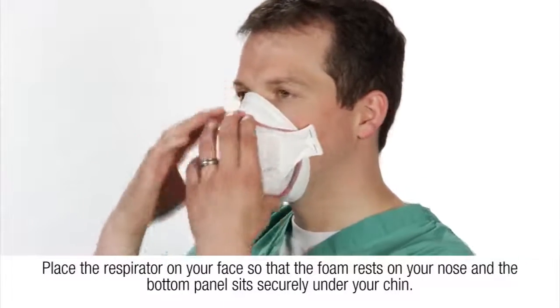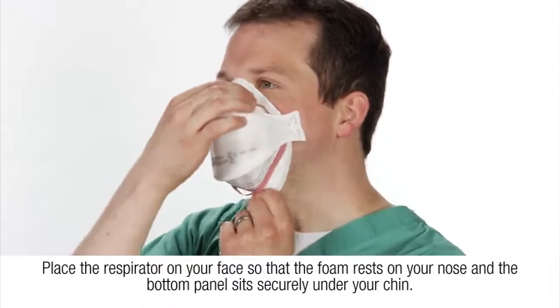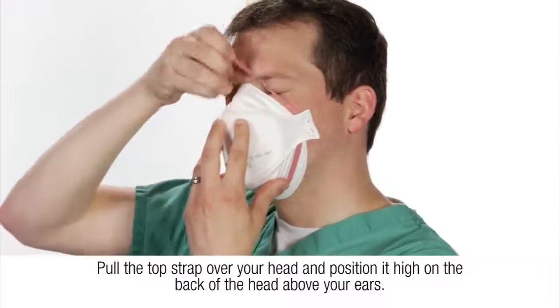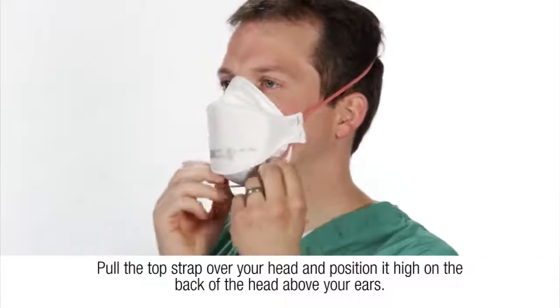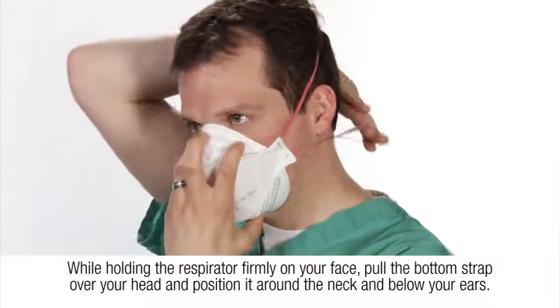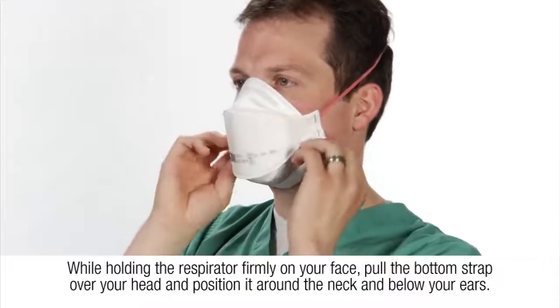Place the respirator on your face so that the foam rests on your nose and the bottom panel sits securely under your chin. Pull the top strap over your head and position it high on the back of the head above your ears. While holding the respirator firmly on your face, pull the bottom strap over your head and position it around the neck and below your ears.